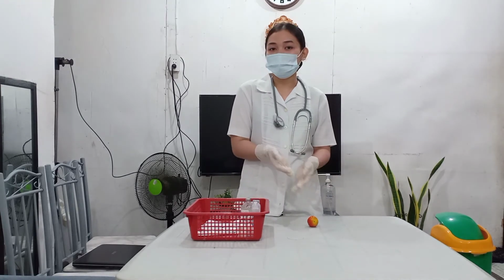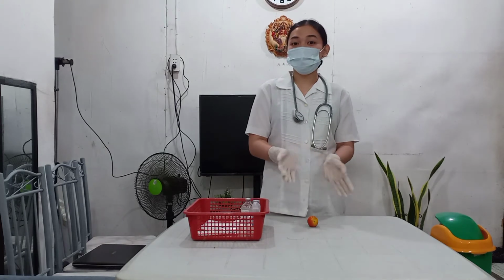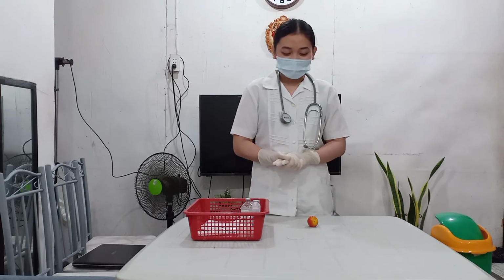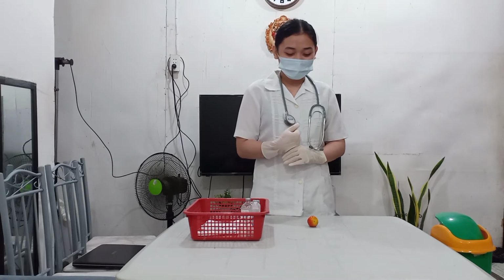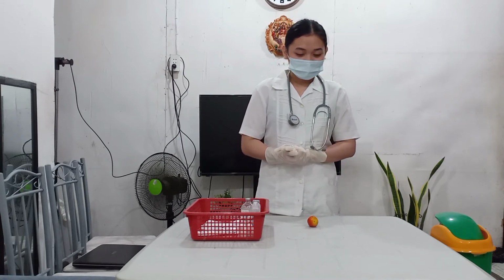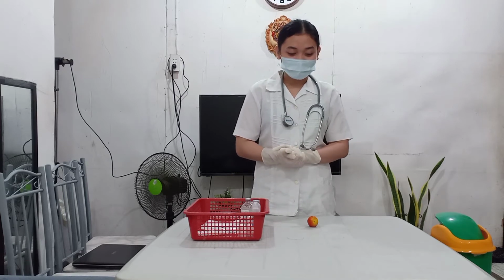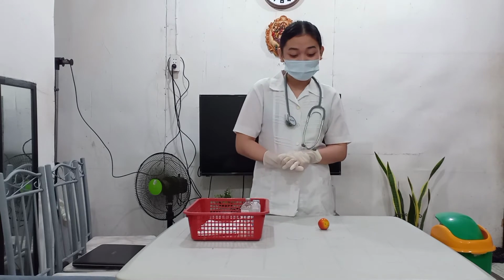So I have here a tomato, assuming that this is my patient for today. Now I will introduce myself to the client. So, good morning, sir. I am your student nurse for today and I will be injecting you for our skin test. What's your name again, sir?